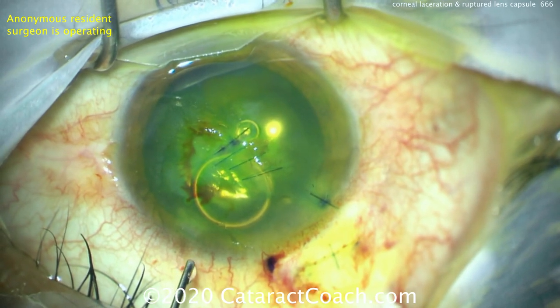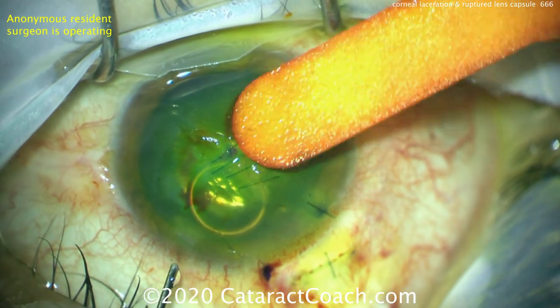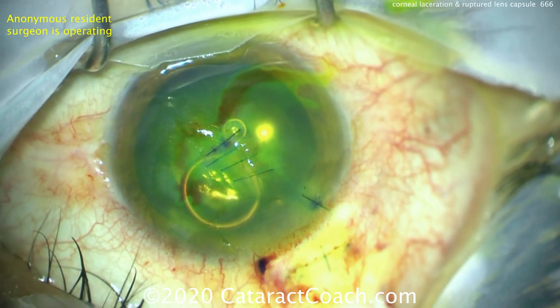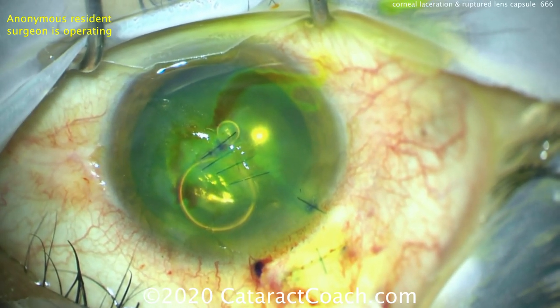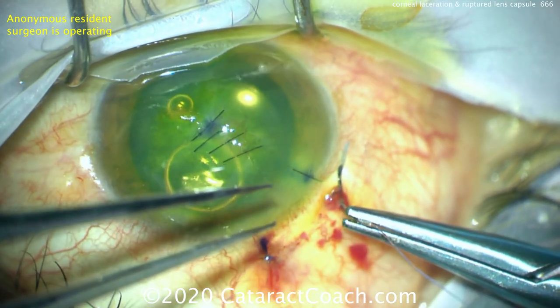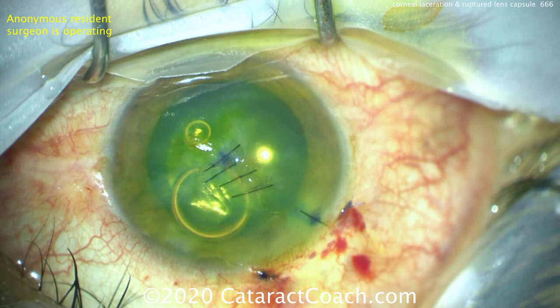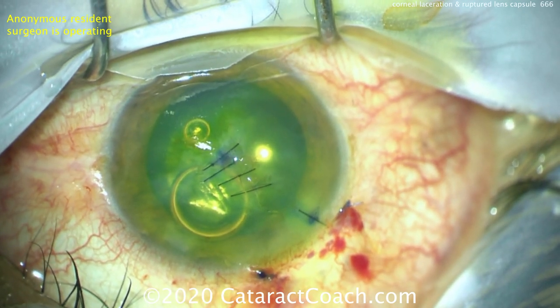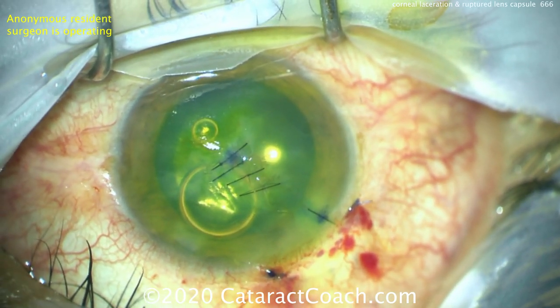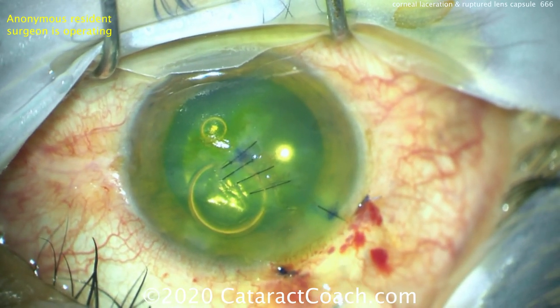At the end of the case, remove the OVD from the eye and fill the AC with BSS. Suture all the incisions and perform a Seidel test to make sure everything looks good. You may also want to take a specimen for culture at the beginning of the case to make sure there's no infection. The Seidel test looks great. Consider a retrobulbar block of Marcaine to keep the patient comfortable post-op. Subconjunctival and intracameral antibiotics, then patch and shield the eye. On post-op day one, temper expectations — don't ask the patient to read the Snellen chart. Be patient, give it time. We can do more surgery in the future. First, let's close that globe.